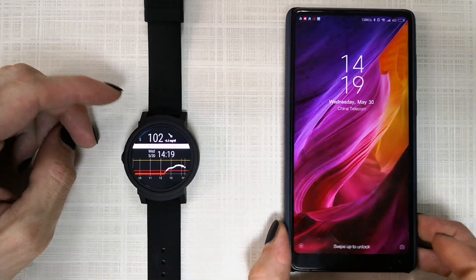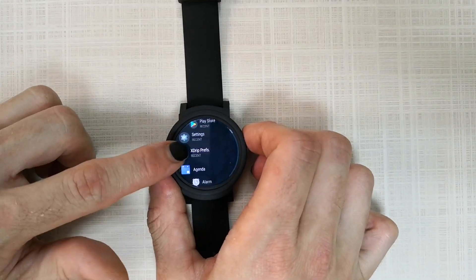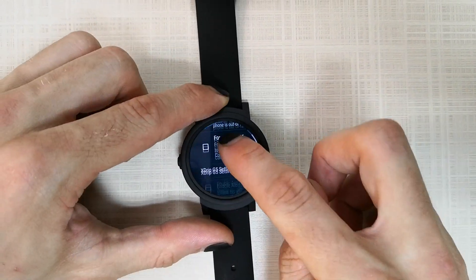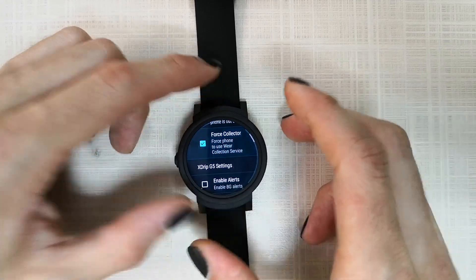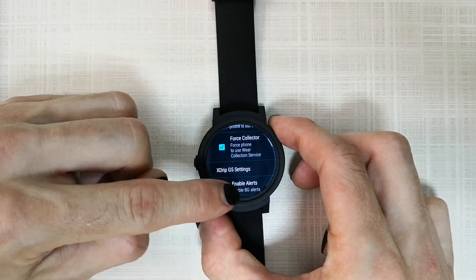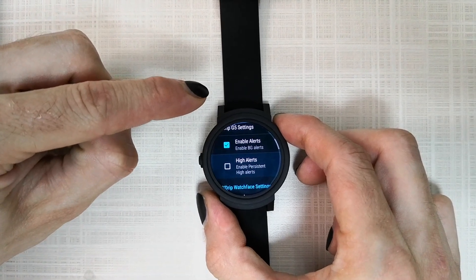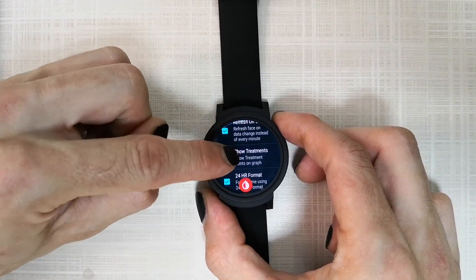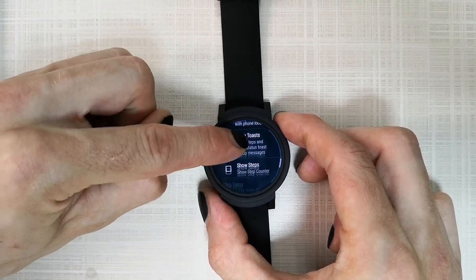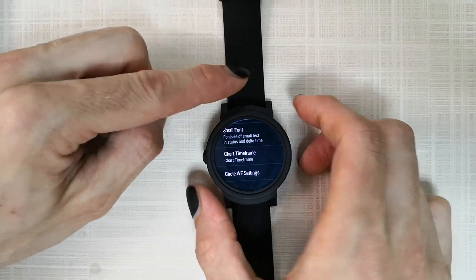After this, you can remove your phone and directly connect the watch to your sensor by pressing Settings, going to xDrip settings, and enabling the collector. Check all these settings and you're done.